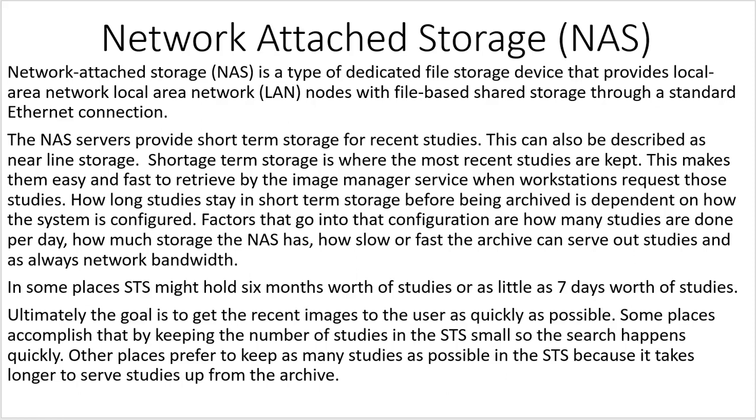Factors that go into that configuration are how many studies are done per day, how much storage the NAS has, how slow or fast the archive can serve out studies, and, as always, your network bandwidth. In some places, STS, or short-term storage, or NAS, notice I'm using these two acronyms to talk about the same piece of hardware. The NAS, or short-term storage, might hold 6 months worth of studies or as little as 7 days worth of studies. Ultimately, the goal is to get the recent images to the user as quickly as possible.